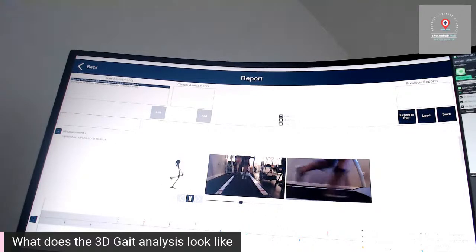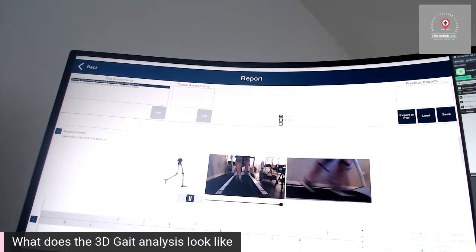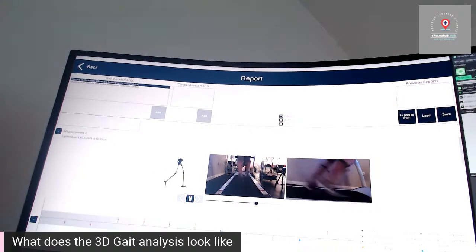So I just wanted to show you what the kind of back end of it looked like. So once a patient comes in, the type of person that comes in, they might have back pain, hip pain, knee pain, a bit of pain in their body, and they just want to work out why they're getting that pain in the first place. So that's our job, to basically do a thorough assessment to see, right, well, why are they getting pain? It might be that somebody's maybe running a marathon, running a couch to 5K. It's maybe proactive training they're wanting help with, or maybe they're wanting to improve their speed, or whatever it is. Maybe they're wanting to compare one set of running shoes to another, or one orthotic to another. Maybe it's gait retraining. There's a multitude of reasons that patients come in and see us.